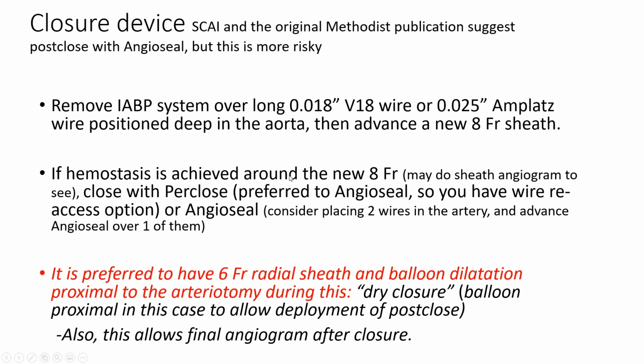Another tip regarding closure device, the hand maneuvers are slightly different than deploying them in the femoral artery, because the axillary artery has more elastic lamina and less muscular lamina than the femoral artery. So the tension required on the closure device anchoring is less. You don't want to do excessive tension in axillary versus femoral. With excessive tension, you can pull through the whole system, because again, that axillary artery doesn't have as much muscle.